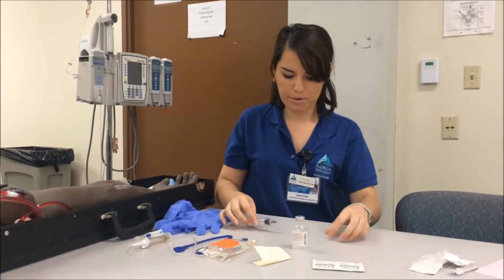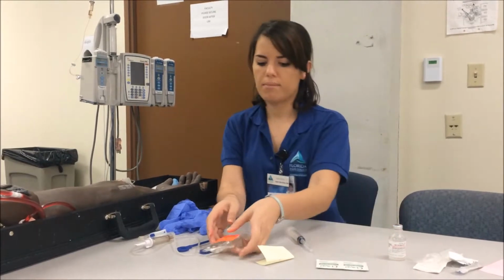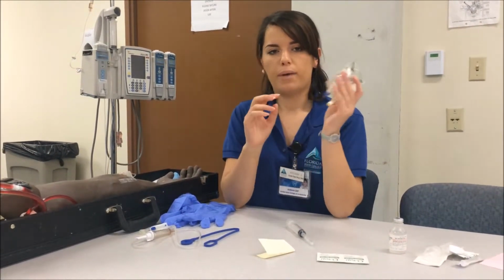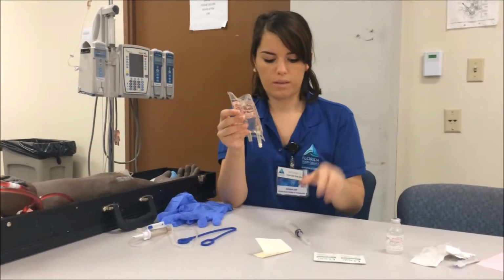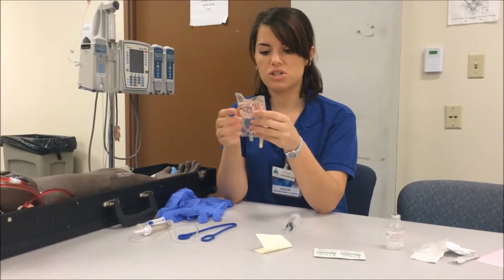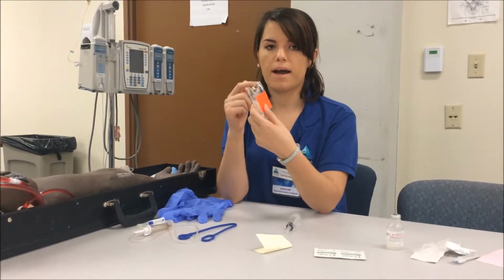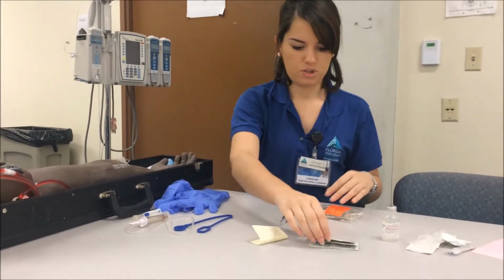Okay, so this time I'm going to go ahead and fish for my needle. Okay, and I will take my bag of fluid here, and I will make sure to label it with my drug name, which was Phenergan, and the patient's name, the dosage, and the frequency of administration, and my initials, and of course date and time.